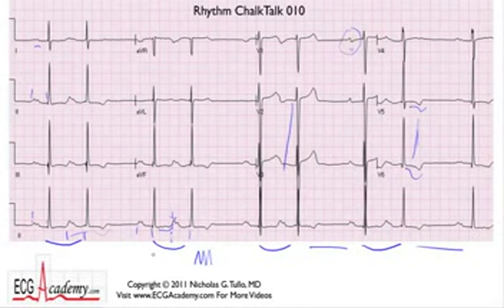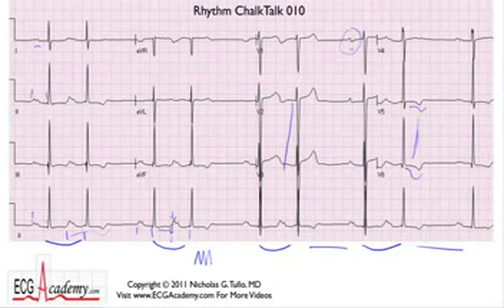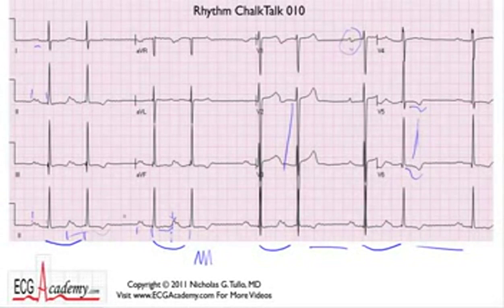You can use calipers if you don't trust me, but my eyes are looking at this and saying this is almost 360 milliseconds — very long. So you've got group beating, you've got pauses, and PRs are getting longer. So what do you think?